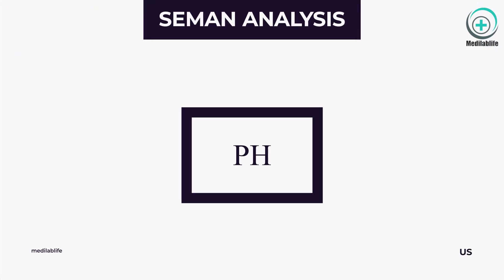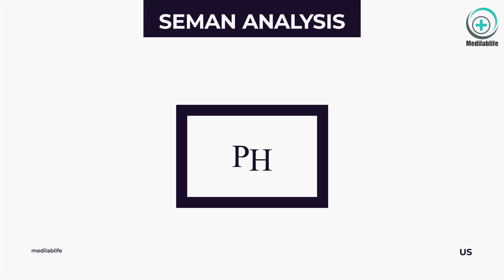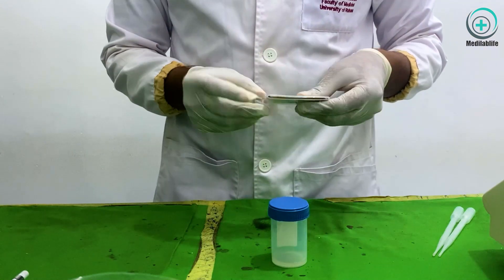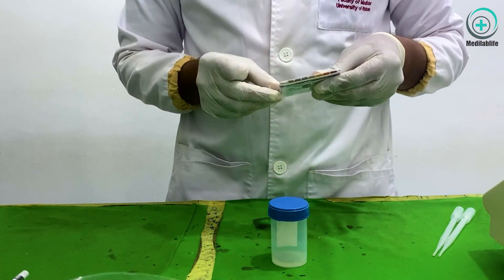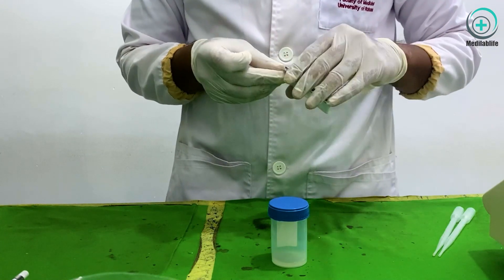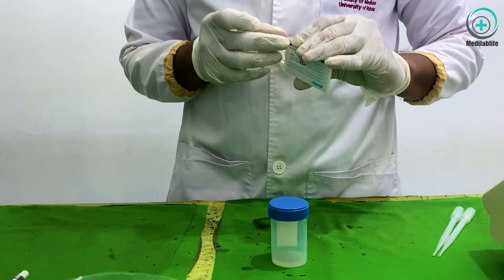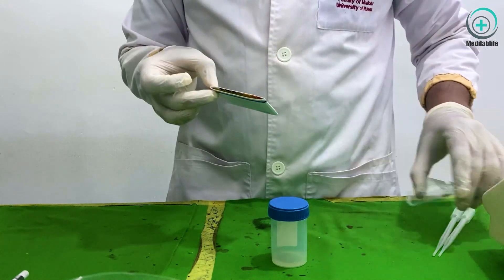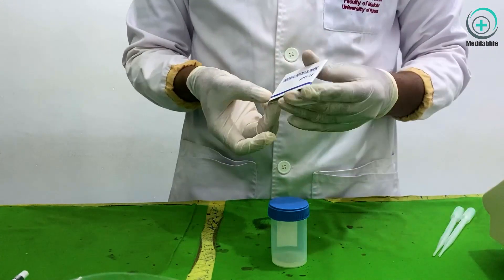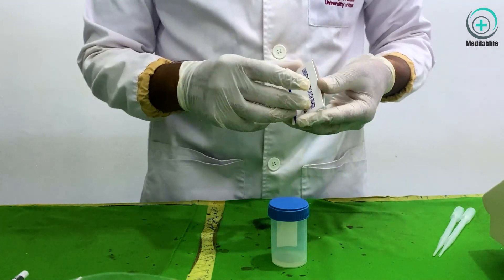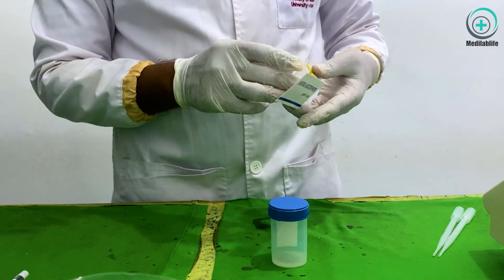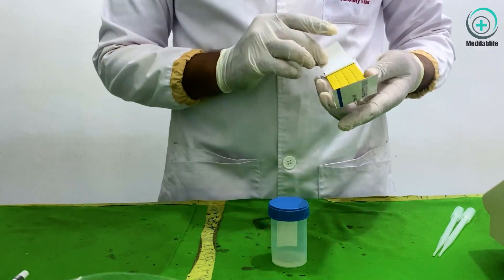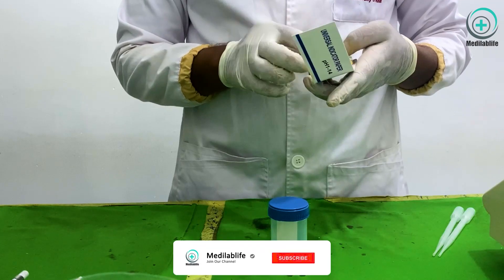pH. Take a strip of either broad-range or narrow-range pH paper and touch one surface onto the semen sample. Observe the pH paper for color change. A more accurate laboratory pH meter can also be used to determine the pH.